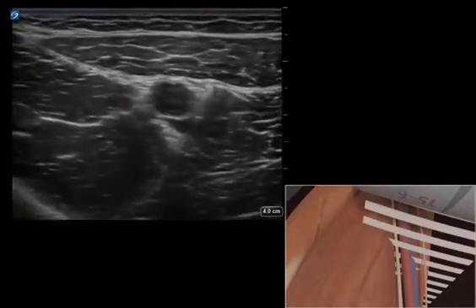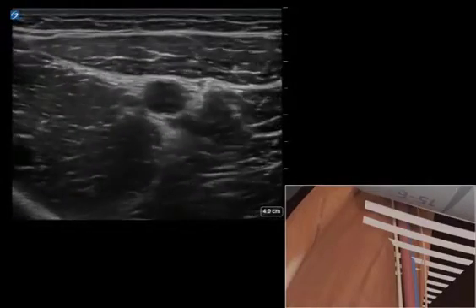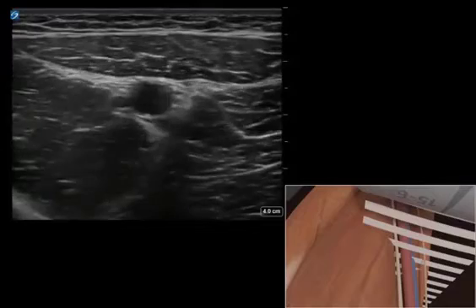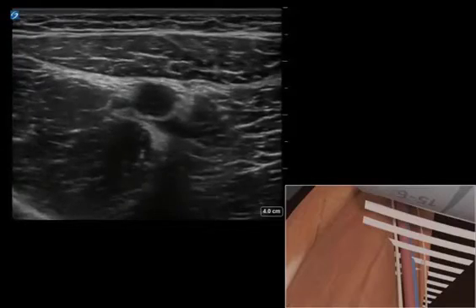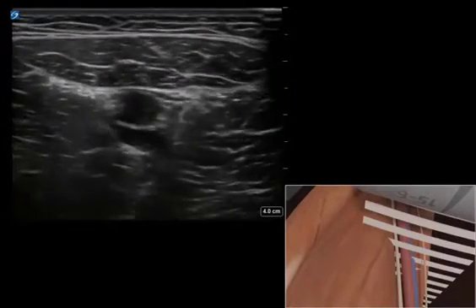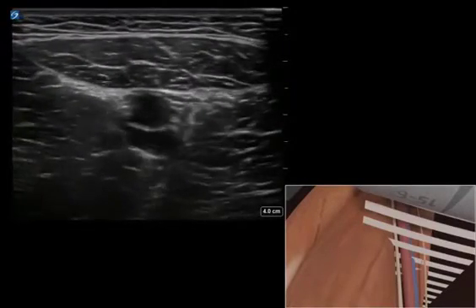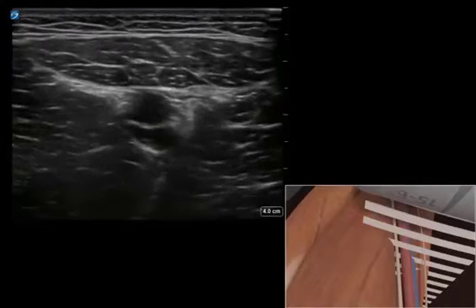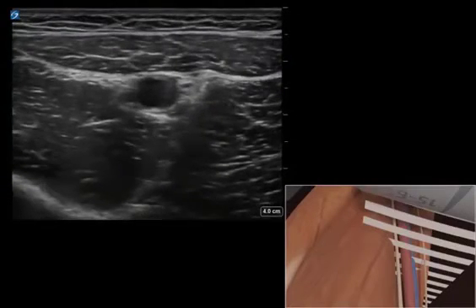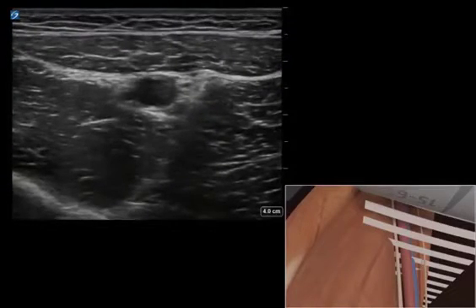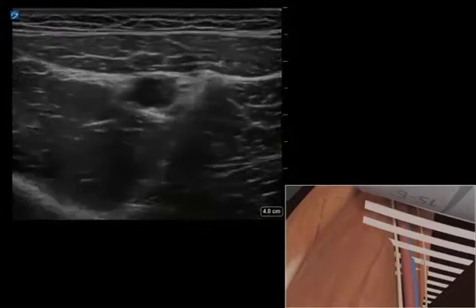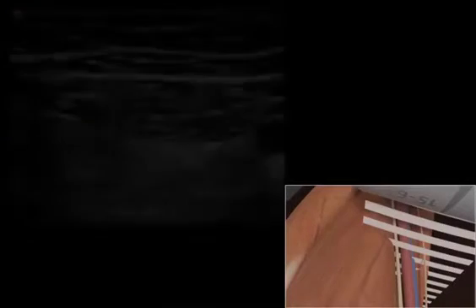When the nerve is visualized at this location, it appears as a small, round, hyperechoic image on ultrasound. If the saphenous nerve cannot be visualized on the ultrasound image, the target should be lateral to the femoral artery below the sartorius and above the vastus medialis muscles.